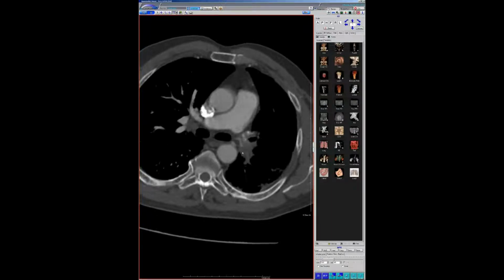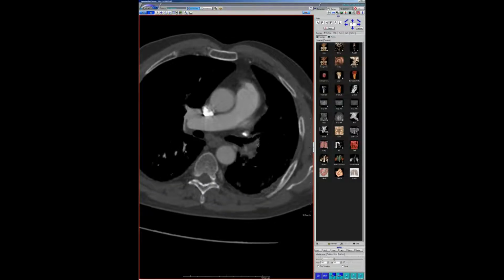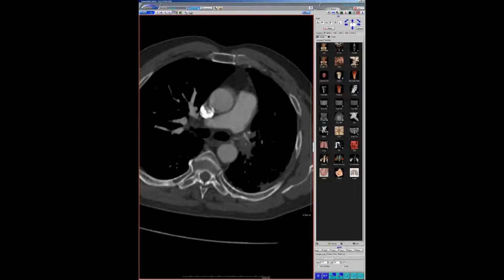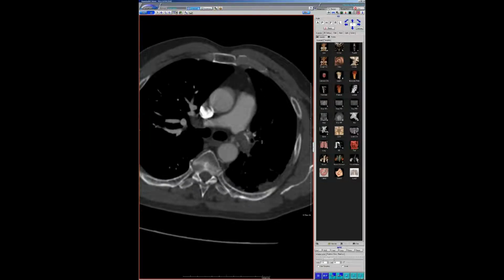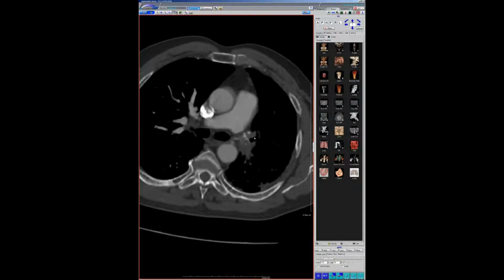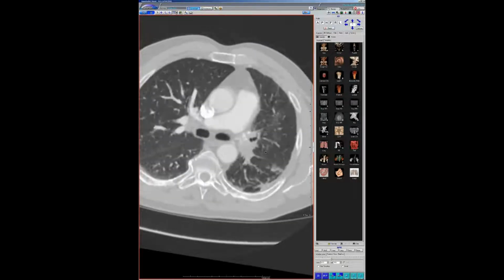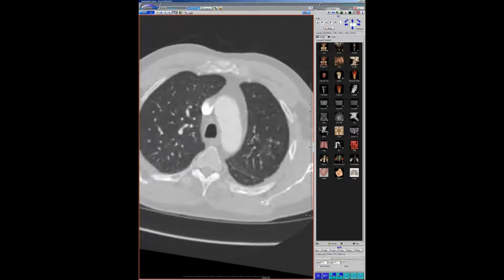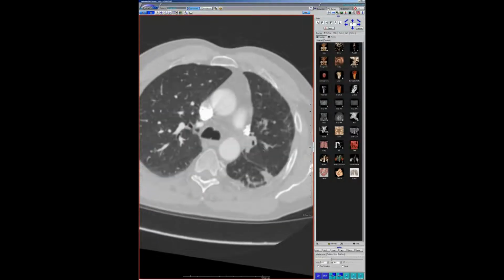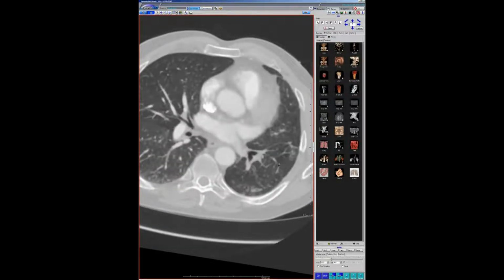So here you can see all these really large bronchial artery branches, which is not surprising. And he's had this for a while, I guess. He's a younger guy, but he's probably had this for a good decade, if not more. But this is fibrosing mediastinitis with complete occlusion of a PA, complete occlusion of a pulmonary vein, mimicking CTEPH, and also on the chest X-ray, kind of mimicking unilateral absence of a pulmonary artery.